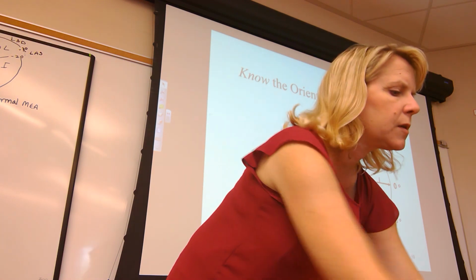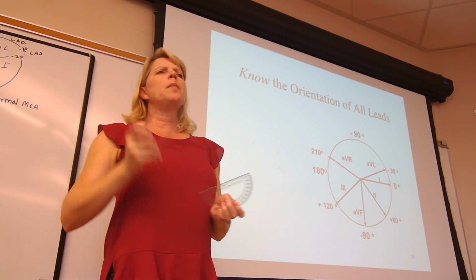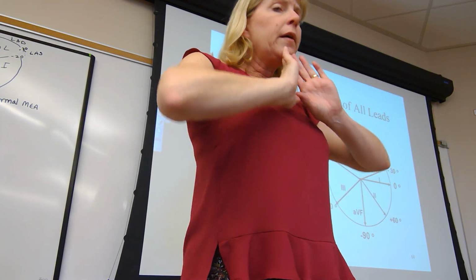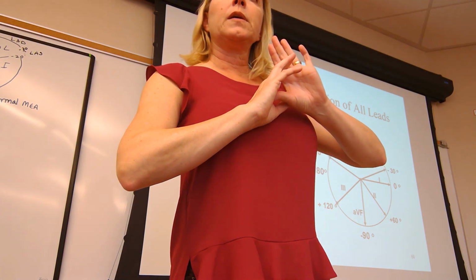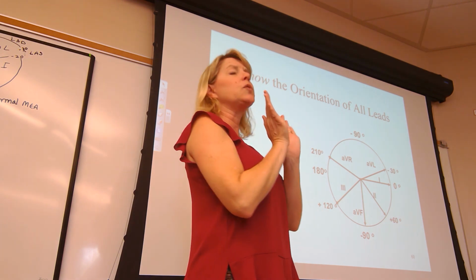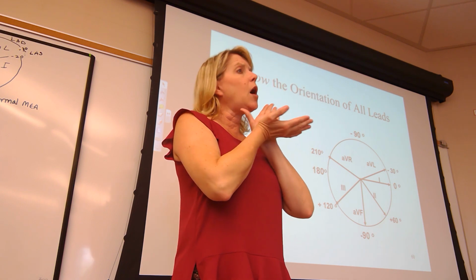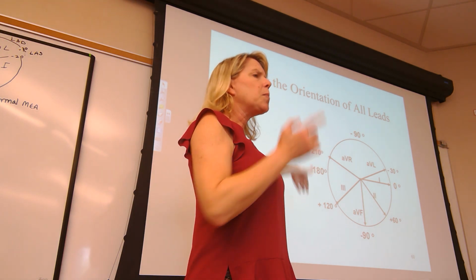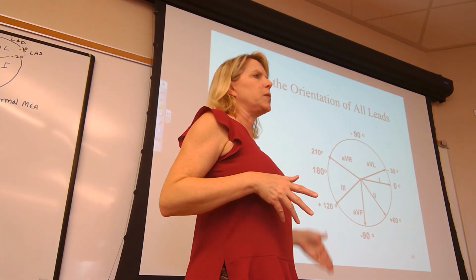Remember we talked about this on Tuesday, right? A compass. Do not memorize the degrees that these leads point to. You will have a picture of the compass in your exam. You are expected to determine someone's MEA using the compass, using leads 1 and 3. So you will have a compass on your exam. You can always reference that. Do not memorize the degrees, but do know the overall direction that these 6 leads point to.